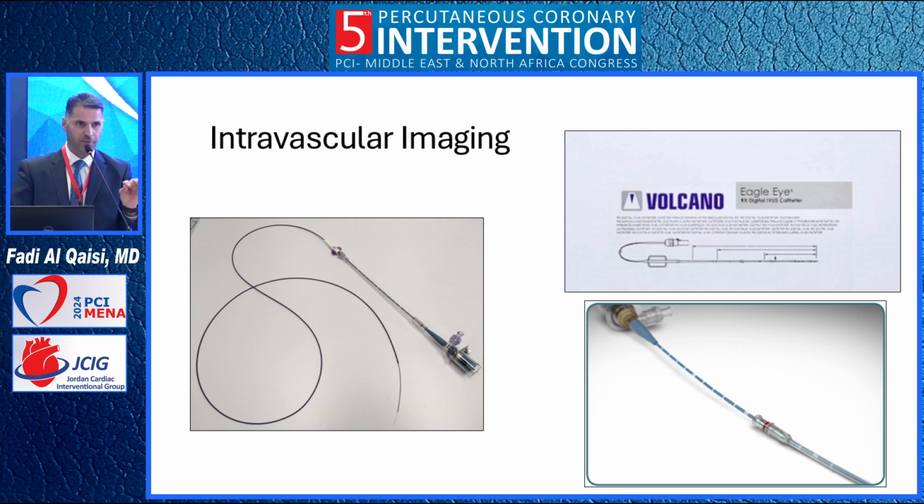Sometimes it can hurt our arteries. The other ultrasound, which is a beautiful ultrasound, is the Boston Scientific ultrasound. It moves inside the sheath, very slick, very small, with no interaction with the artery, and it just became available in Jordan. Our colleagues in the services brought it; we wait for them to finish with the device, then take it from them and start using it outside.